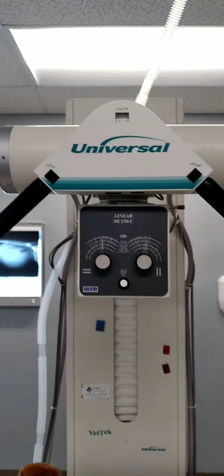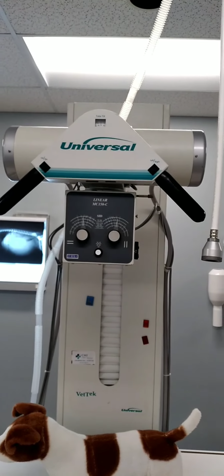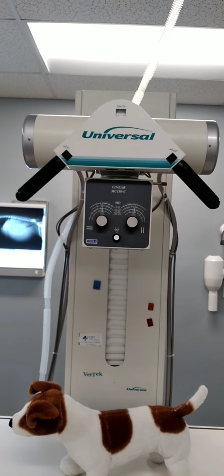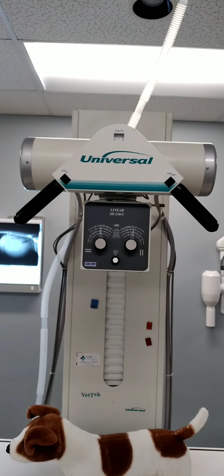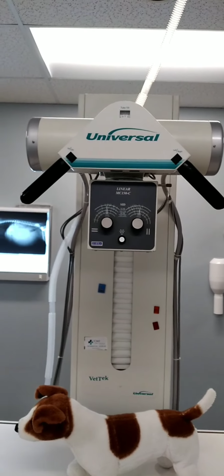And this is our X-ray tube with the knobs left and right for collimation. The black pegs are for manipulating, and then you can see the cylindrical shape at the top. That is your actual X-ray tube.